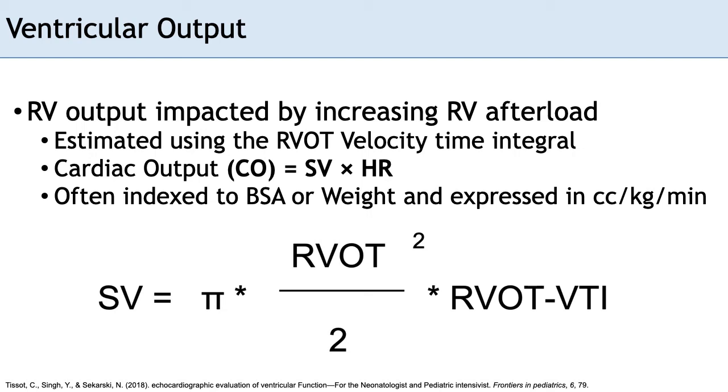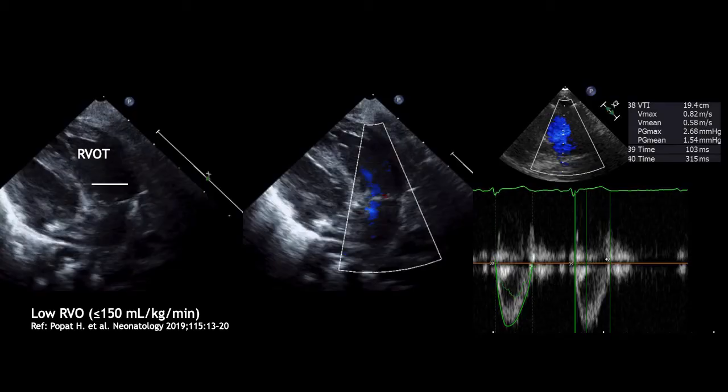So obviously there's variations there. But if it's used consistently by one operator, typically it is valuable information for estimation of the performance of your ventricle, especially when you're following a patient in which you want to monitor the response to certain treatments.